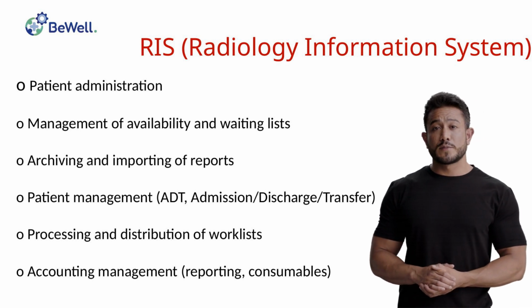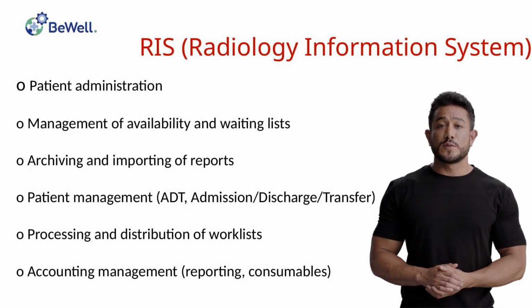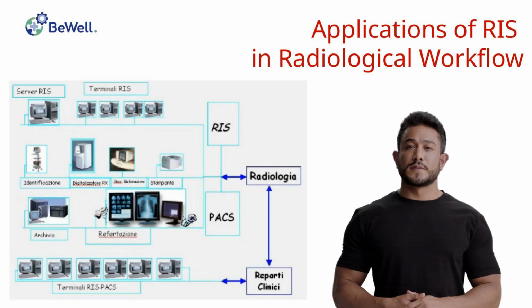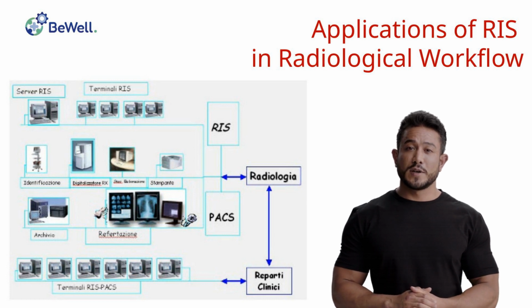Patient management: admission, discharge, transfer. Processing and distribution of work lists. Accounting management, reporting, consumables. Then, applications of RIS in the radiological workflow.